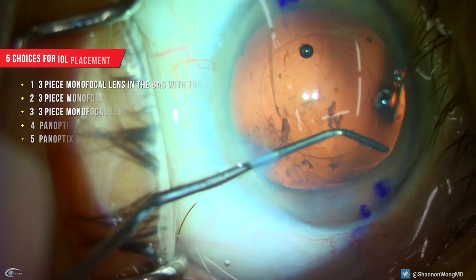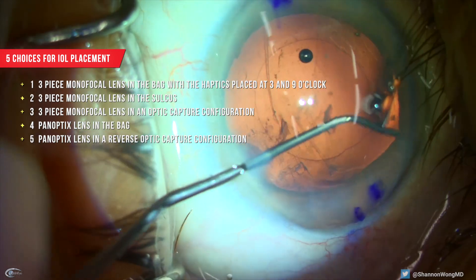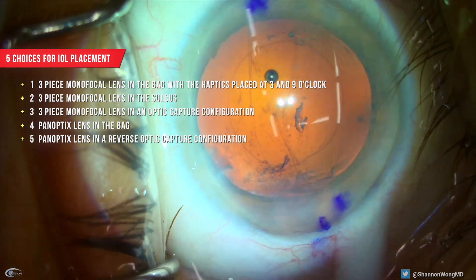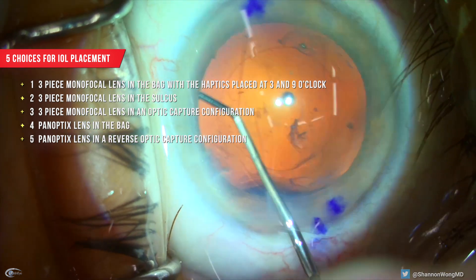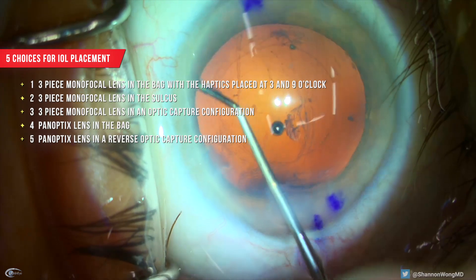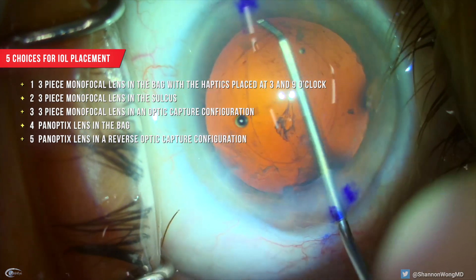Now we have five choices on the lens implant to use and how to place it. Number one, a three-piece monofocal lens could be placed in the bag with the haptics placed at three and nine o'clock. Number two, a three-piece monofocal lens could be placed into the sulcus.